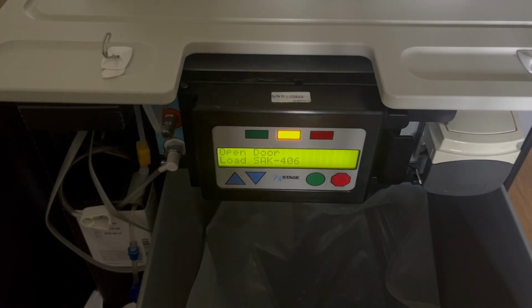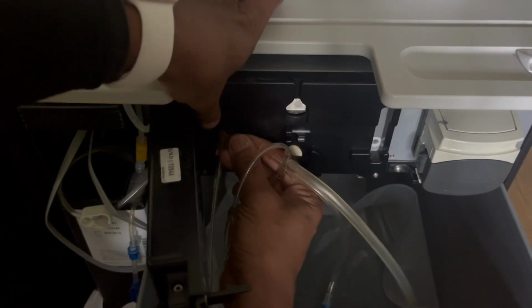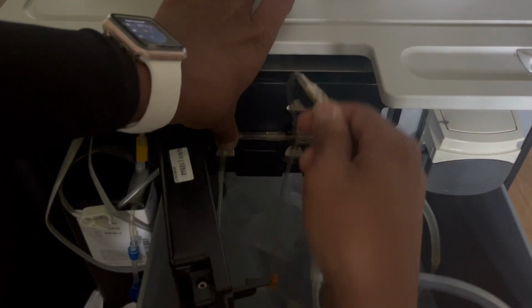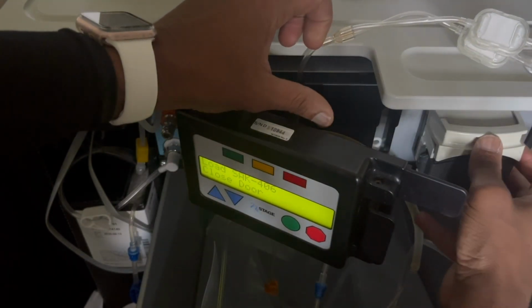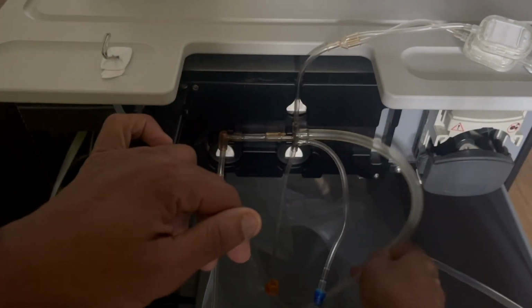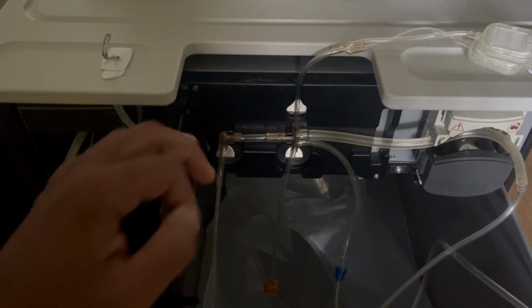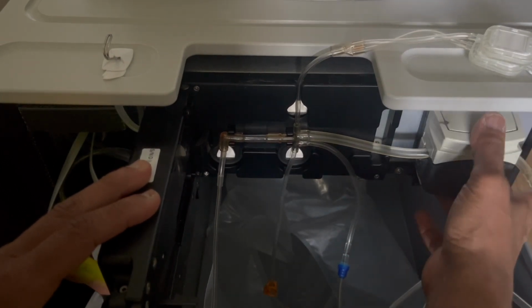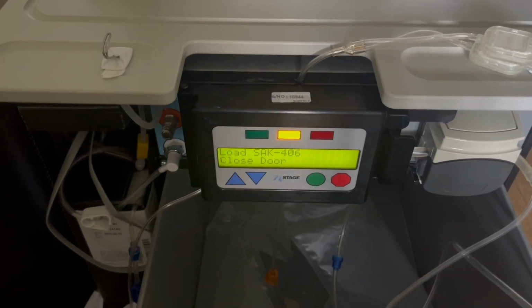Alright, the next thing we're going to do is open the control panel door, and you're going to see a little T section where the tubes are, and just fit that in where it goes. The blue tube is on the left side, the orange tube with the orange cap is in the center. You have the tubes that go on top, and then on your right side there's a thick tube which you put inside the pump right there, and then the other one hangs down. Right, so make sure they're all snug and inside their little fits right there. Make sure you close the pump next, and after that you're going to close the control panel door, right? And you're going to hear 3 more clicks, and then it's going to say connect lines.